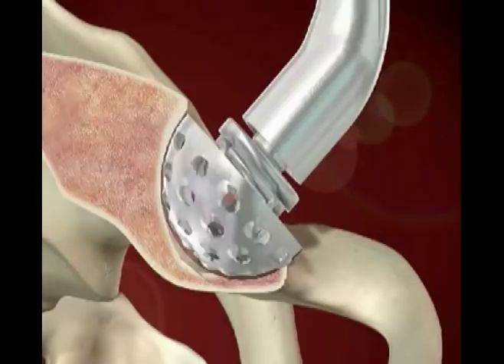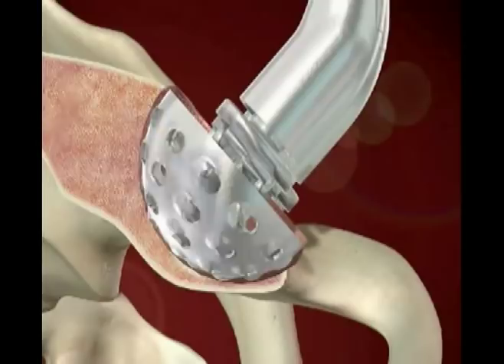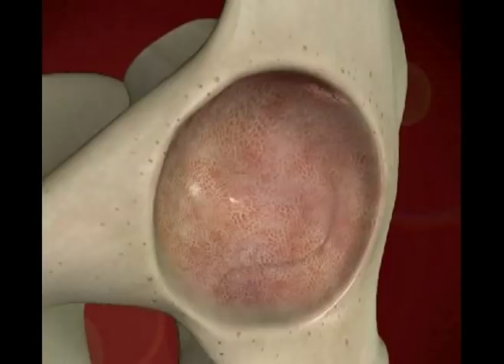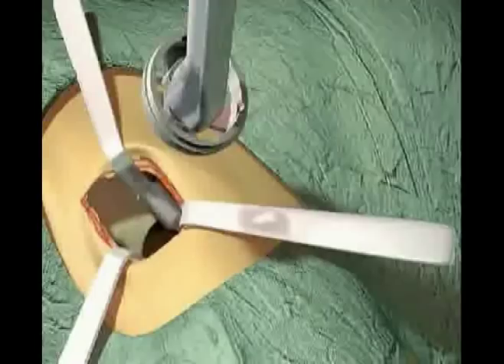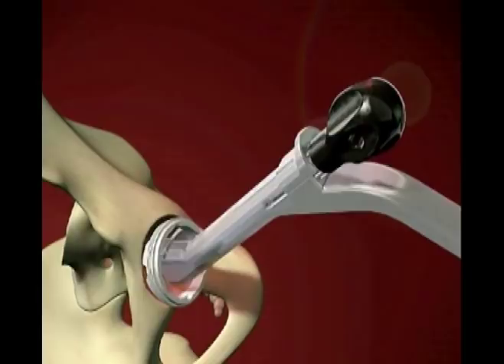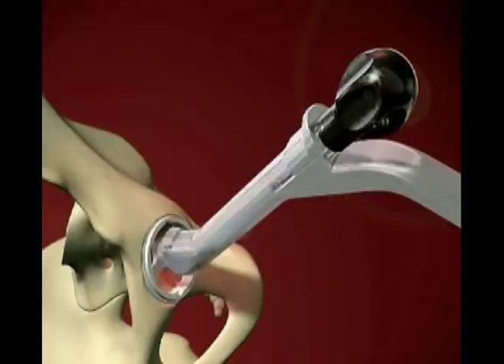Reaming stops when the socket has become a true hemisphere and when the reamer makes contact with the anterior and posterior walls of the acetabulum. Following preparation of the acetabulum, a trial shell 1–2 mm larger in diameter than the last reamer is attached to the threaded connector of the acetabular inserter and introduced to the acetabulum. Appropriate trial shell orientation can be verified with external alignment guides in addition to natural landmarks such as the transverse ligament. The trial is used to assess the coverage of the acetabular component and to gauge the seating depth of the actual cup.